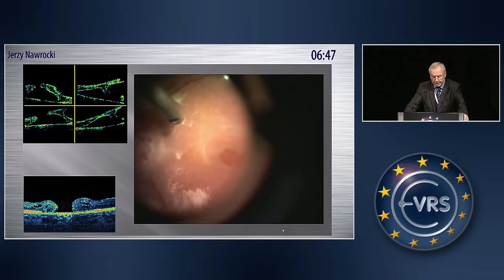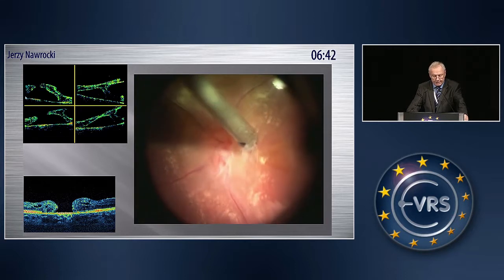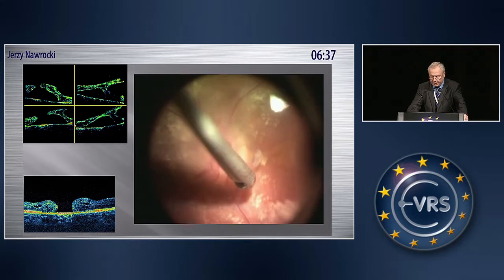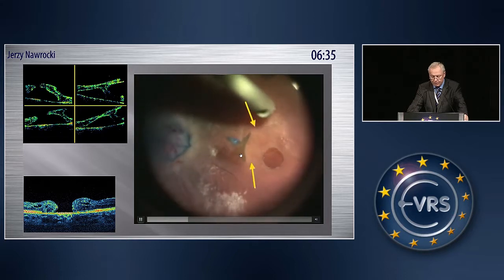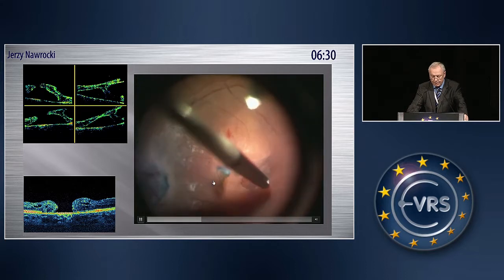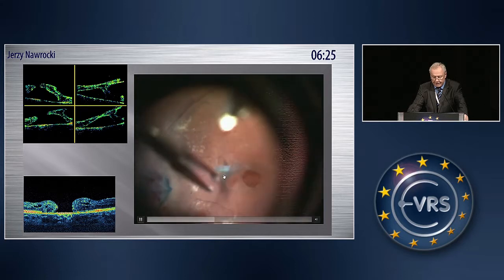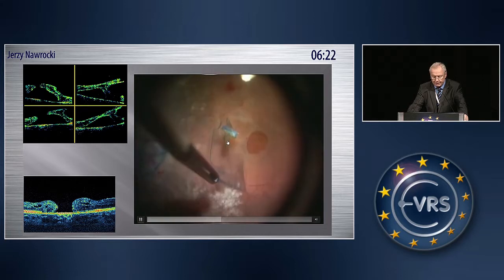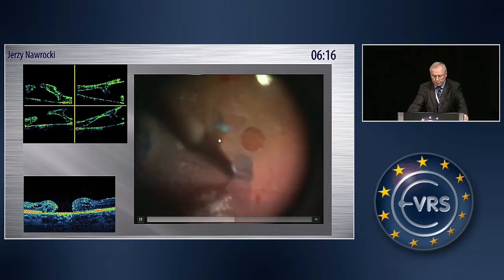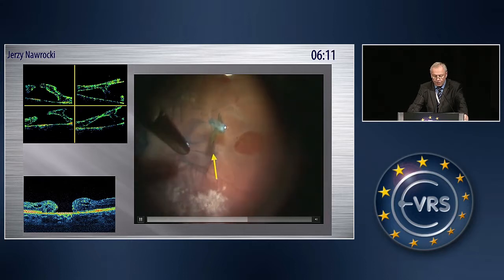But here you see a specific case which I had in 2005. I couldn't understand the pathology with OCT Stratus because at that time we had only OCT Stratus, but it was splitting of inner and outer retina layers. At that time I peeled ILM all around as usual, and I also tried to peel the ILM from the torn inner layers of the retina, and in a moment you will see that I peeled not only the ILM, but this whitish tissue was also removed.